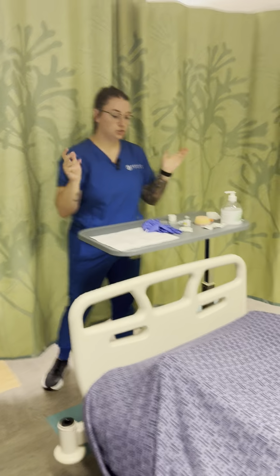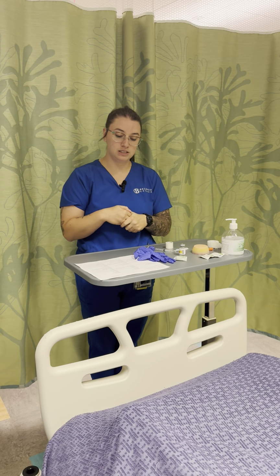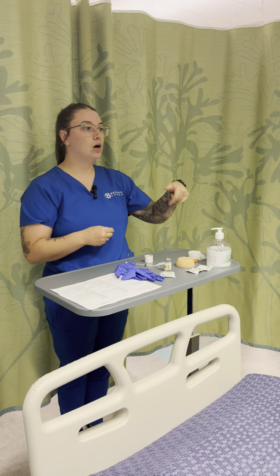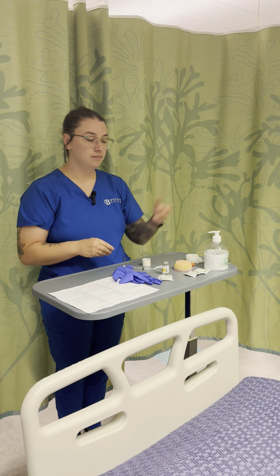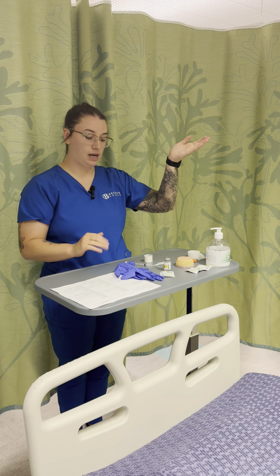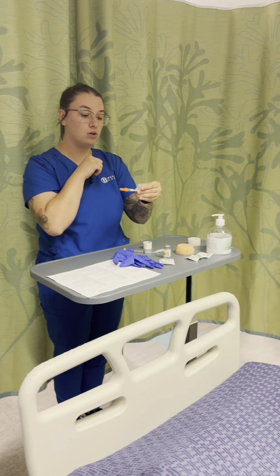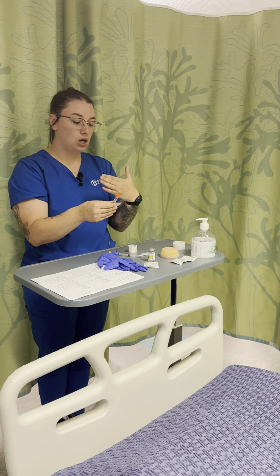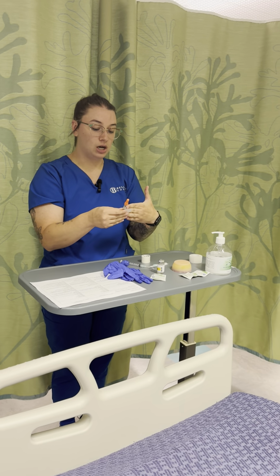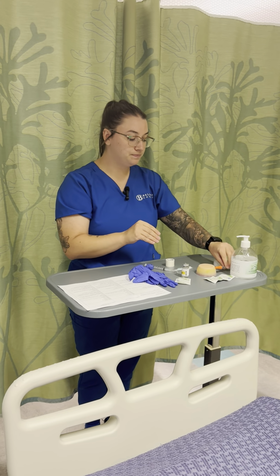All right. So I'm going to administer 7 units of NPH insulin and 20 milligrams of ketorolac to my patient today. Pulling up their MAR, it is due at 9 a.m., which right now is 9 a.m. Dosage is 7 units, and I have my insulin already pre-drawn up with my label on it of 7 units. It is subcutaneous. My name is on it. My patient's name and birthday is on it. The dosage and the route is also on the label.